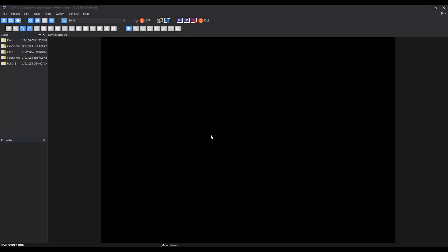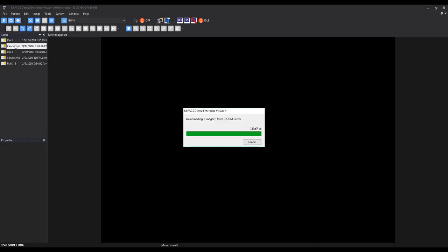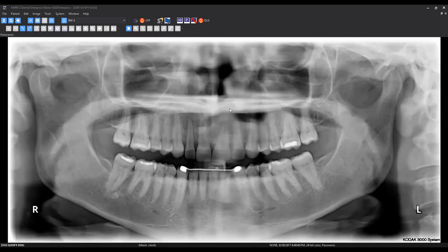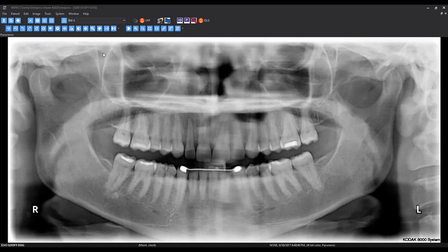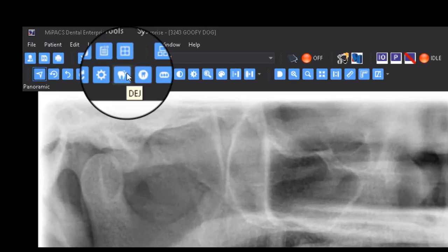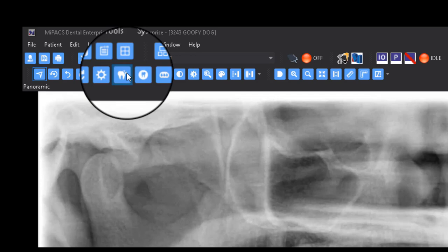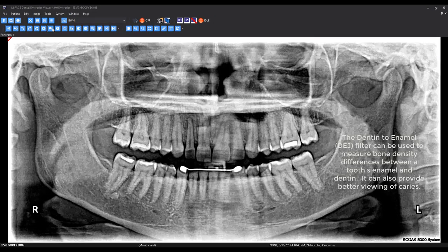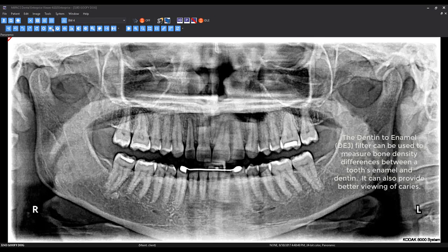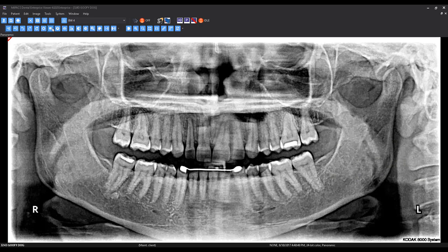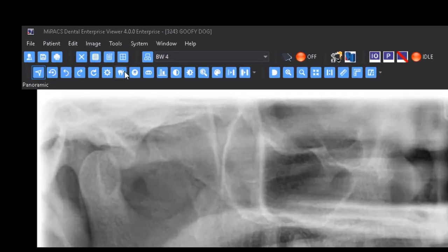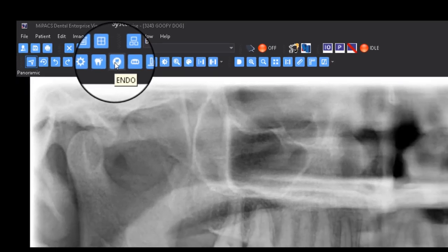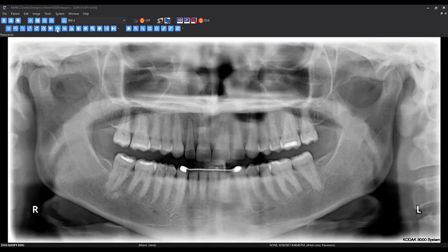The latest version of the MyPax viewer offers some more advanced image filters to aid in diagnosis. They are the dentin-to-enamel junction, endodontic, and periodontal filters. The DEJ filter can be used to help measure bone density differences between a tooth enamel and dentin. It can also provide better viewing of caries. The endodontic filter can be used to highlight root morphology.